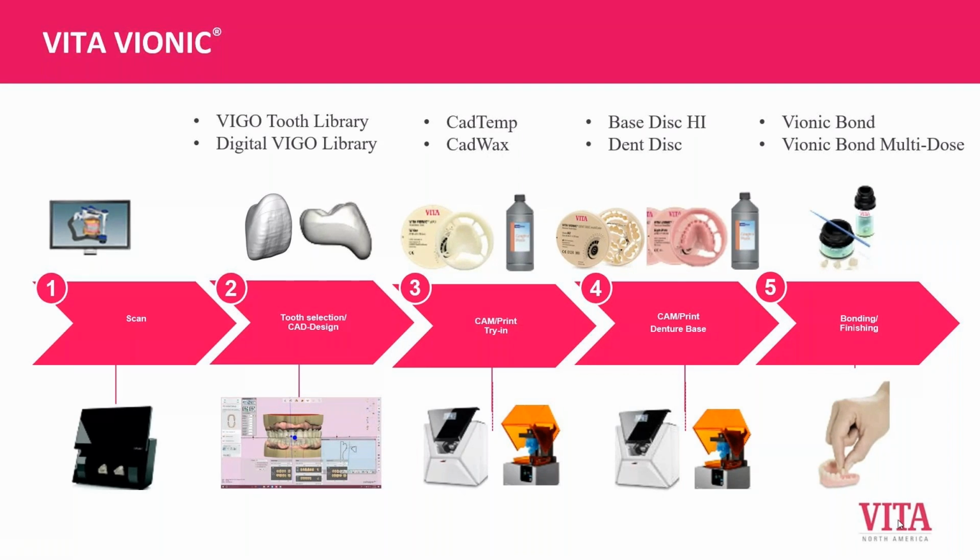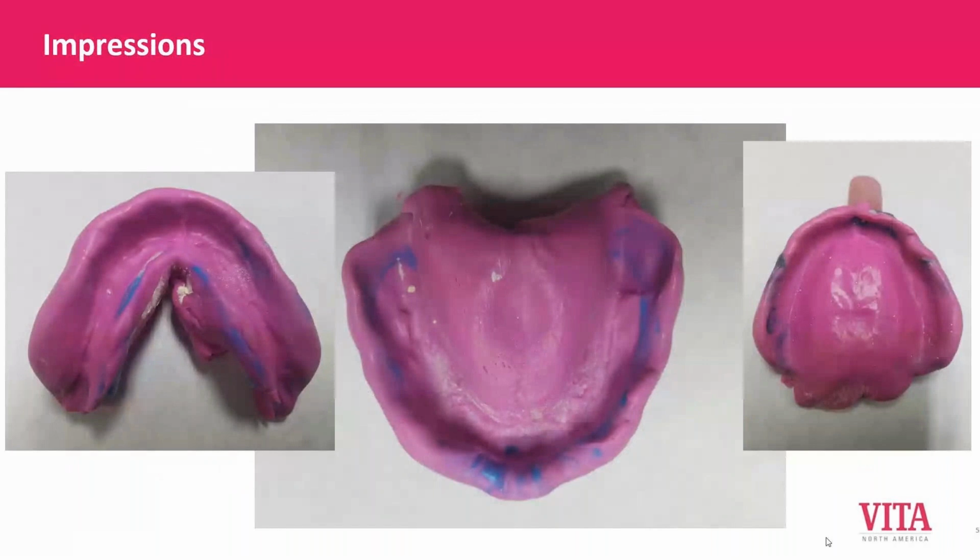But making an impression for a digital denture really shouldn't be any different than making an impression for a traditional denture. So all of the same rules apply. I'm not going to go into deep depth of it now. If you want to know more, call me or email me, and I've got some slides and information on that. Or if you want to take one of my courses, I usually go more in depth on that. But we'll talk a little bit about it.